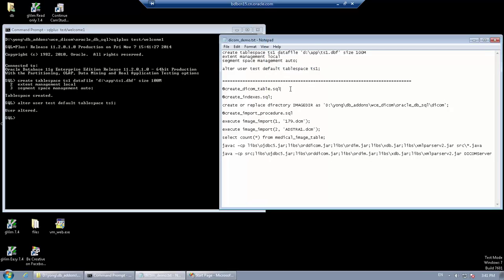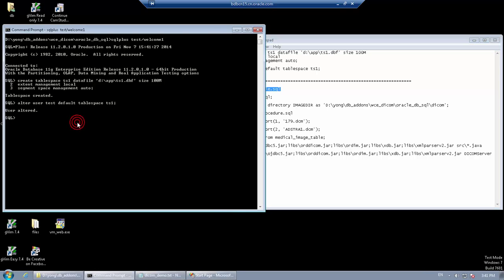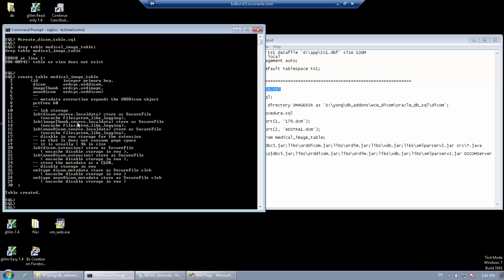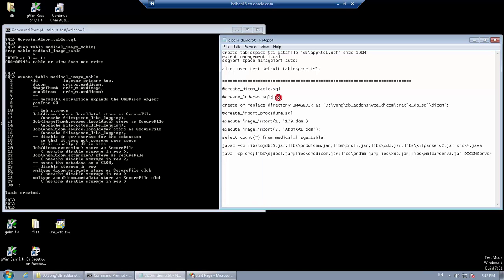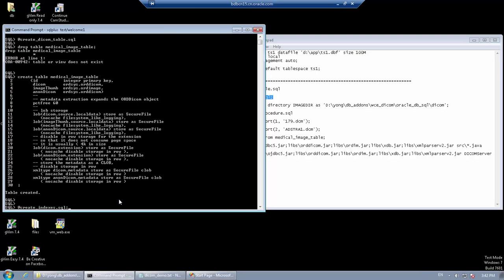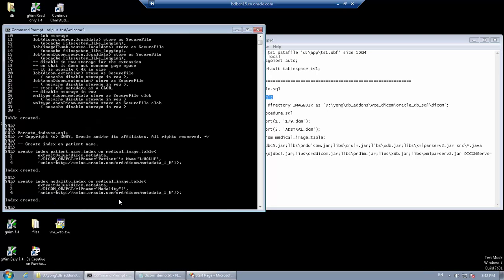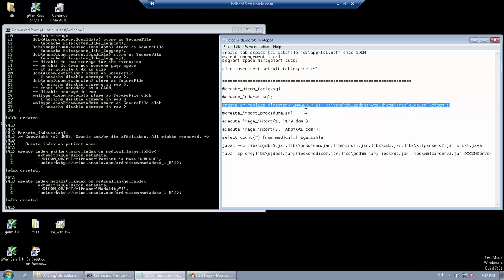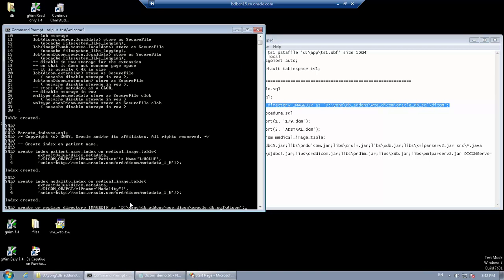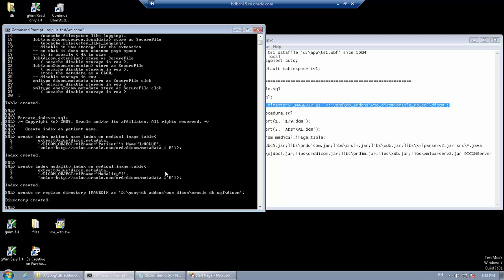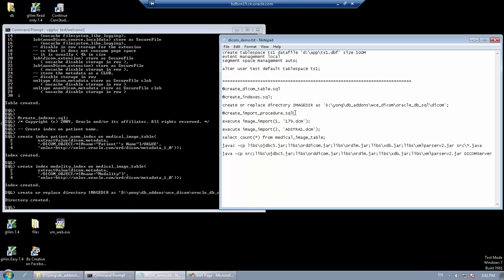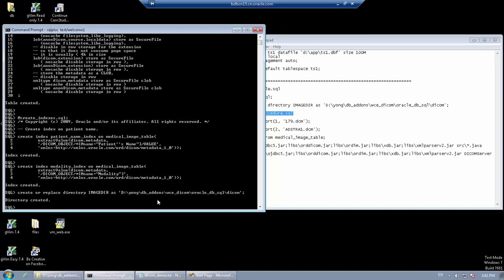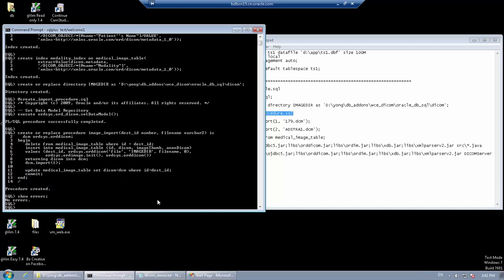Now we can create the table and the indexes. We also need to create a directory object pointing to the directory containing sample DICOM files. Now we create the image import procedure and use it to import two DICOM files.